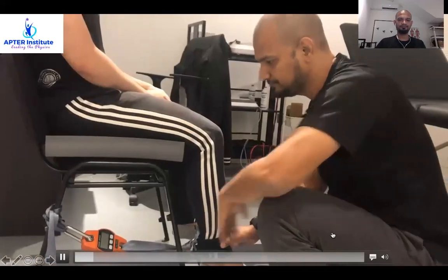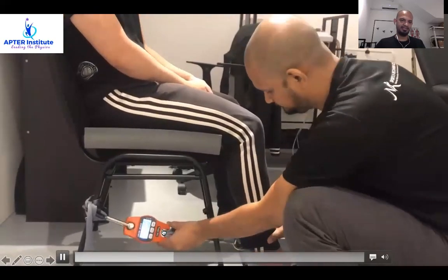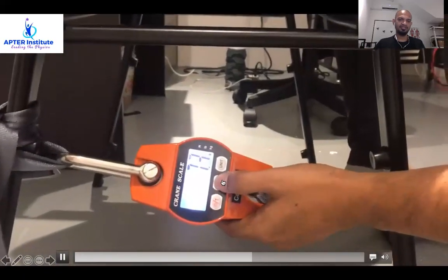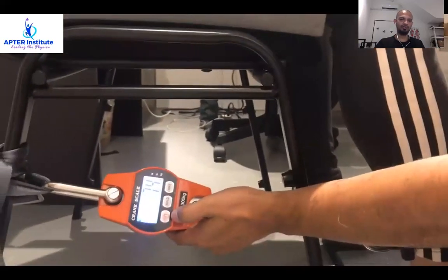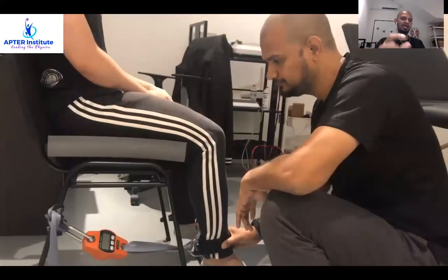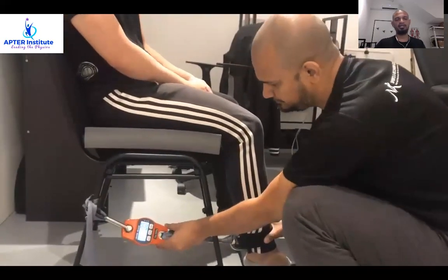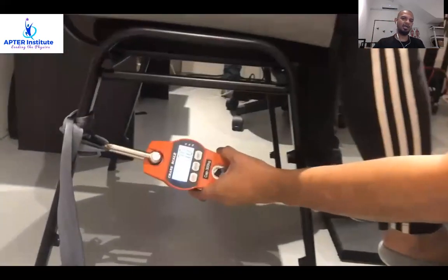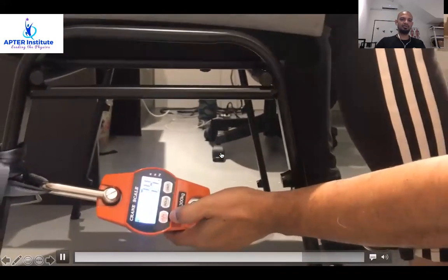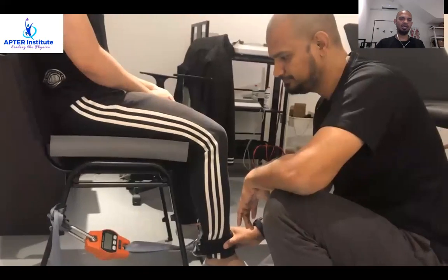If you look at this video, the good thing about the crane scale is that when the patient starts doing knee extension, there's a hold button so that the peak value can be held and memorized in the crane scale. We take around three measurements and make an average of the three to get a value in Newtons, kilograms, or pounds.